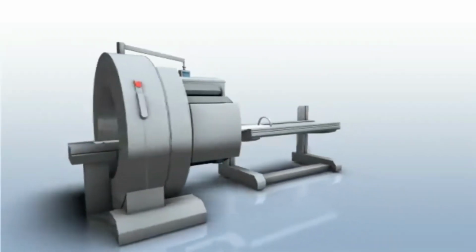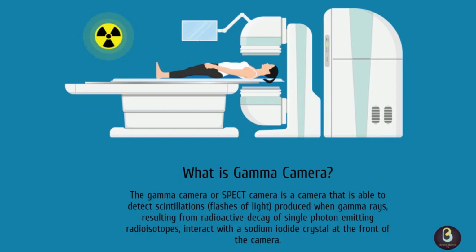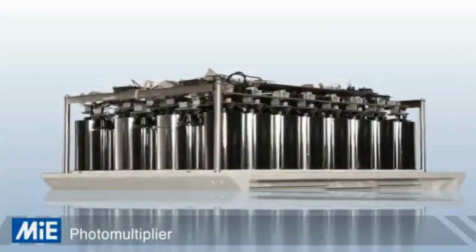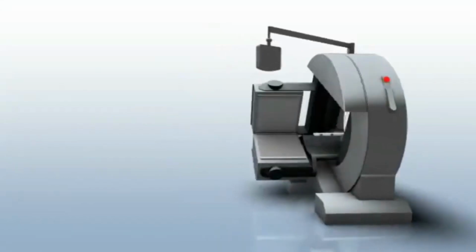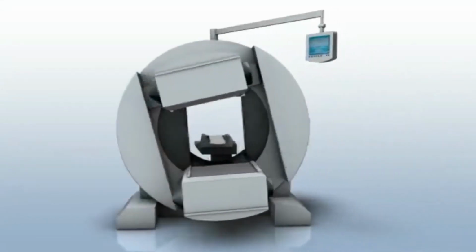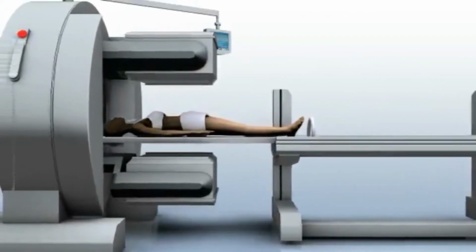So, what is a gamma camera? In layman's terms, the gamma camera, or SPECT camera, is a camera that is able to detect scintillations, flashes of light produced when gamma rays, resulting from radioactive decay of single photon-emitting radioisotopes, interact with a sodium iodide crystal at the front of the camera. Gamma cameras are based on the detection of gamma rays emitted from radionuclides. Radionuclides can be ingested or injected into the body.